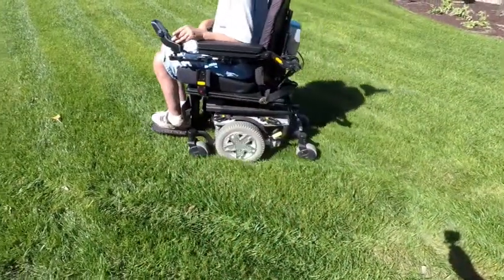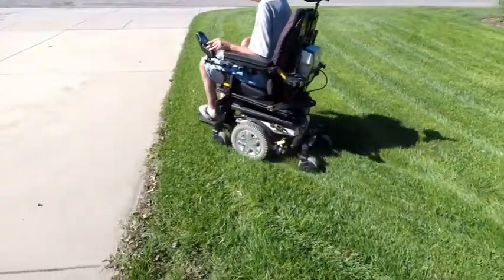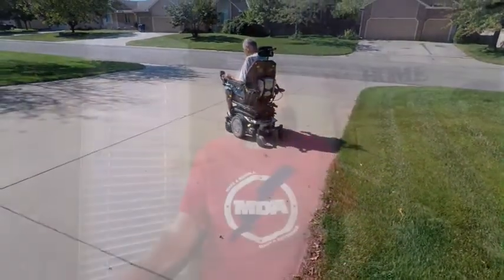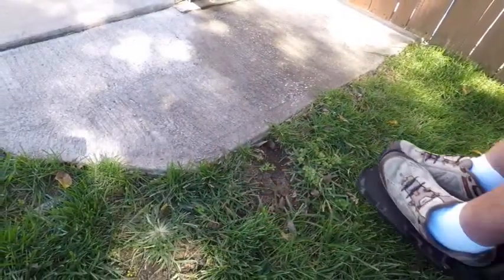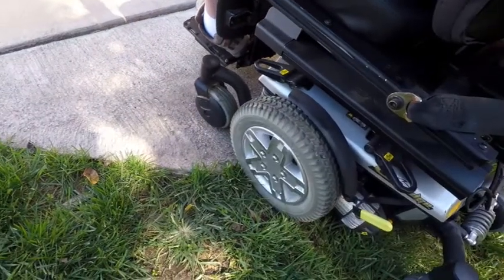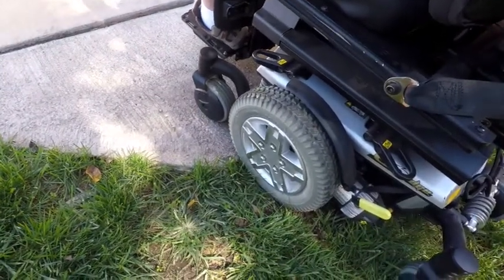Mid-wheel power chairs sometimes have 4 smaller caster wheels, which often makes it a difficult configuration to use on uneven surfaces, such as sidewalks or around the house on the lawn. When operating on uneven surfaces such as a lawn, the mid-wheel configuration may high center on the 4 casters, losing traction to the drive wheels in the middle, resulting in the inability to move forward and backwards.